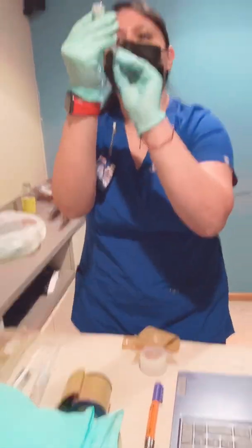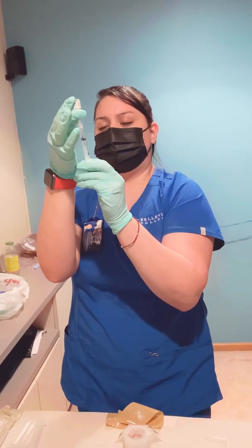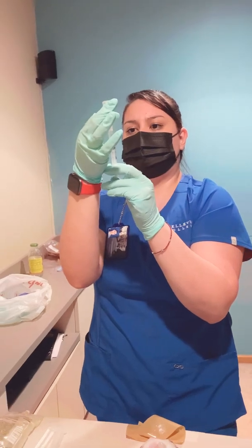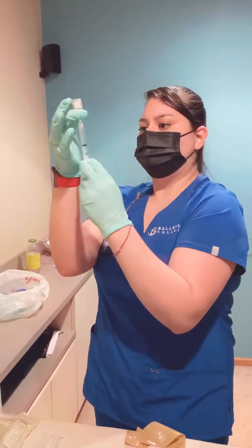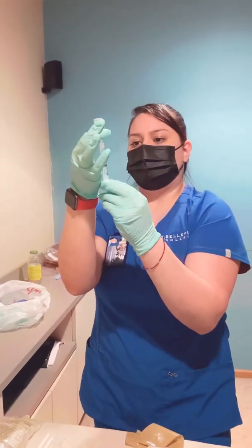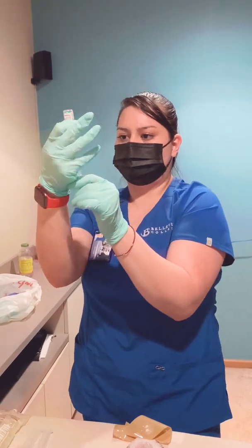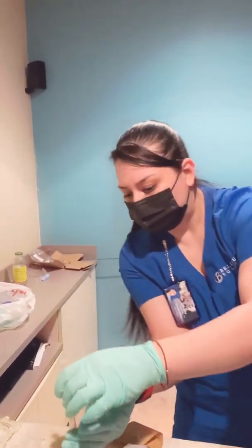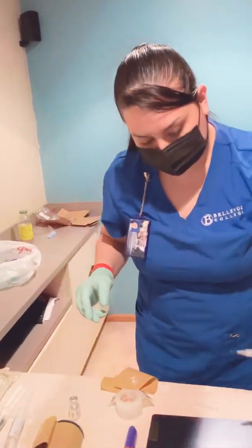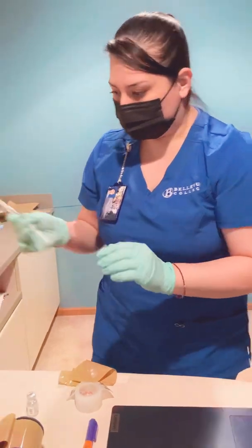And I'm going to pin my vial, inject the air. I'm going to flip it over, and I'm going to dispense into my syringe the amount that I need, about 2 milligrams there. All right, and I'm going to take the bubbles out, check the volume at the meniscus. Looks good. Put the vial back down, and I'm going to single cap my syringe, and I'm going to label it.